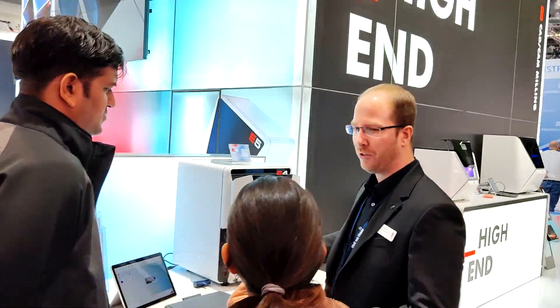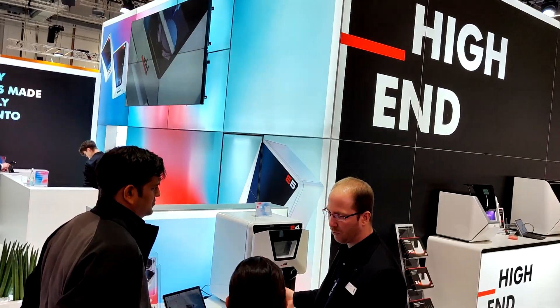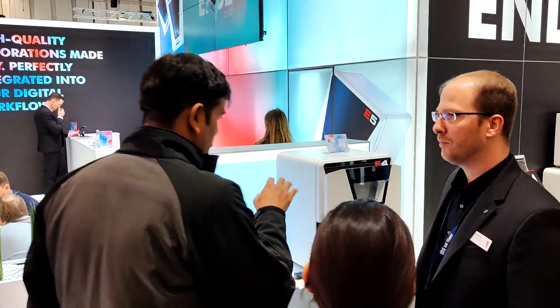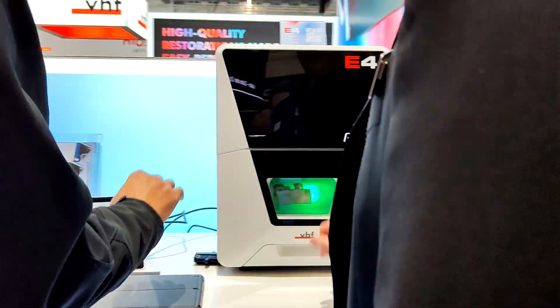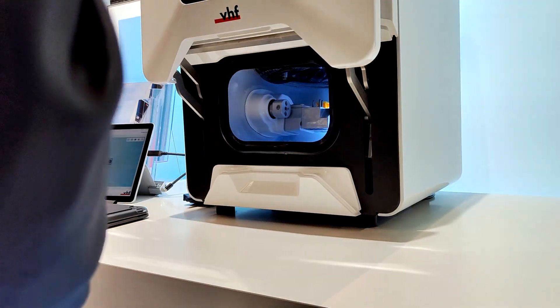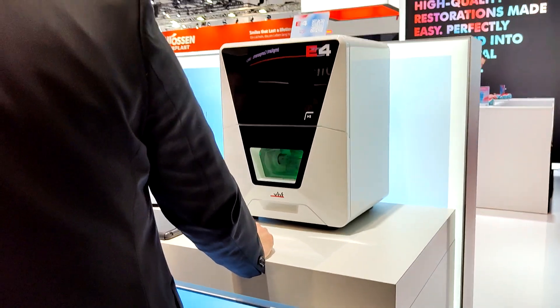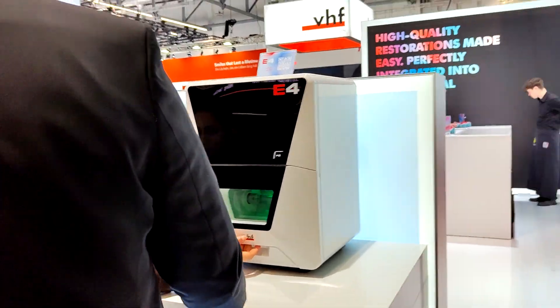The E4 is a wet grinding machine for single blocks up to 40 millimeters — the perfect machine to start same-day dentistry. It requires no compressed air and runs on regular tap water. It supports all kinds of lithium disilicate, and there's also a dry milling option available — an additional tank you can purchase to mill zirconia, PMMA, and composite blocks.